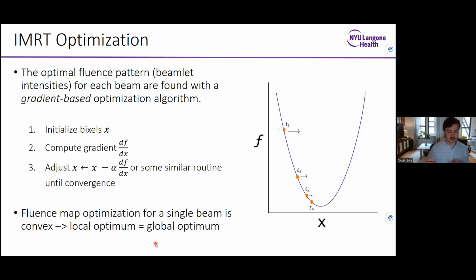So we have our objective function, right? We have an initialized fluence map with a dose influence matrix. Now we initialize all the beamlets, say to an open field, and evaluate. We've been careful about how we specified our objective function so we can compute this derivative of how the objective function changes depending on beamlet intensities.